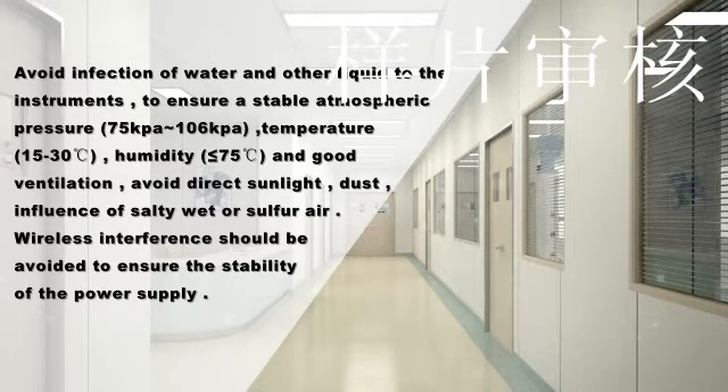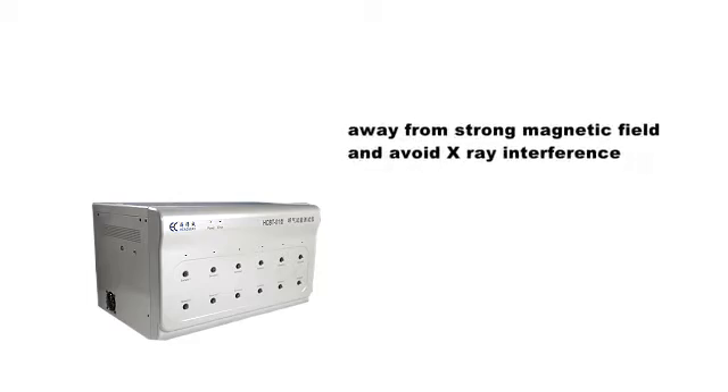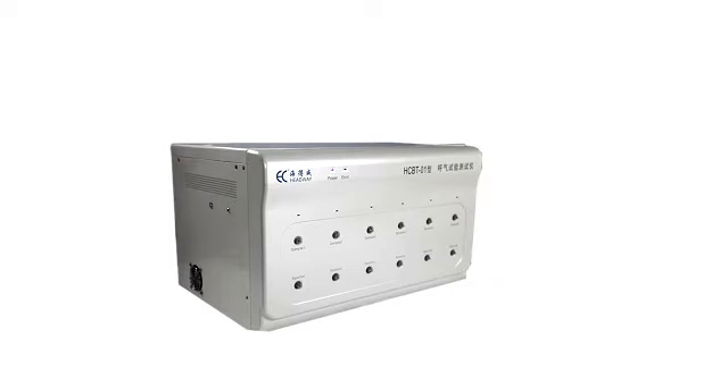Wireless interference should be avoided to ensure stability of the power supply. The instrument should be installed on a flat and stable surface. Avoid vibration, and rough handling is forbidden. Keep away from chemicals and harmful gas zones. Stay away from strong magnetic fields and avoid X-ray interference. No less than 10 cm should be left around the instrument, with enough space in front for connecting and changing the sample bag.